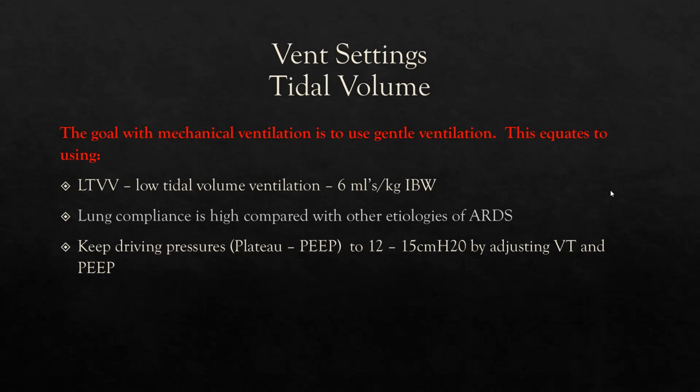So a patient in PRVC is receiving a 400 ml tidal volume. You perform an inspiratory hold and the plateau pressure is 30 centimeters of water. The patient is receiving 5 centimeters of water of PEEP. What is their driving pressure? Very good. It's plateau minus PEEP, the same thing you would use to figure out your static compliance.